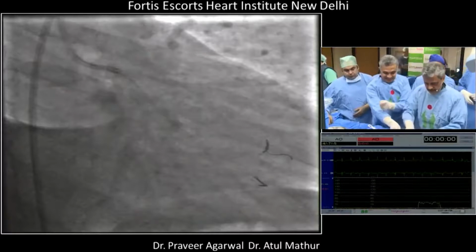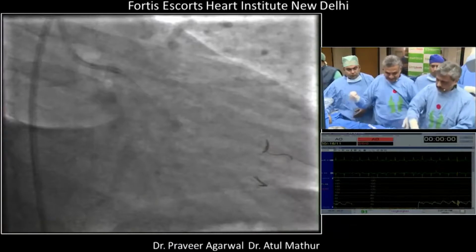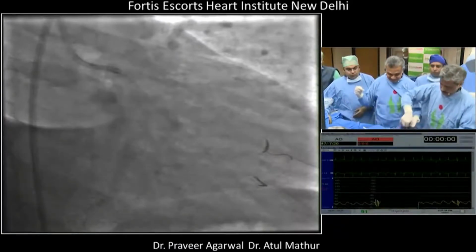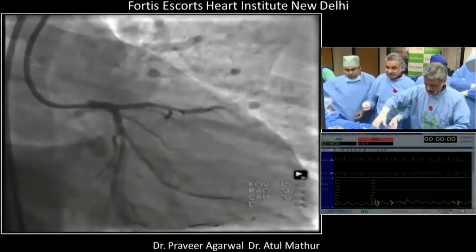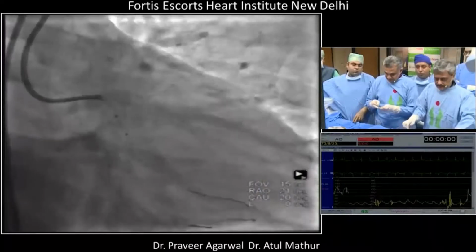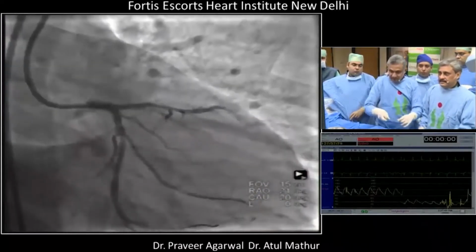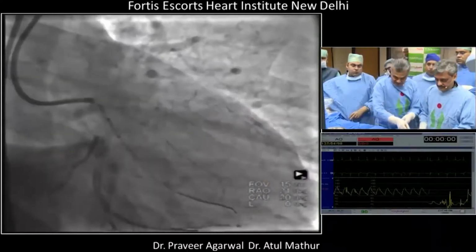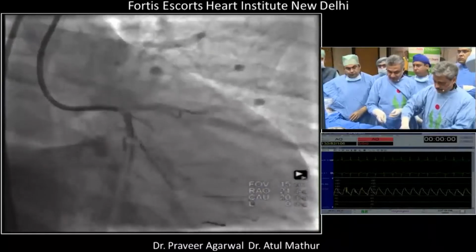Dr. Agarwal, let me ask you a question. In your personal experience with angiosculpt, you can go up to higher pressures. So what is your limit? You can go 18 atmospheres in your clinical practice? Limit is about 18. Yeah, that's what we do also. Usually 18. That's why I think Enrique is asking how the cutting balloon limit is stopped at 14.